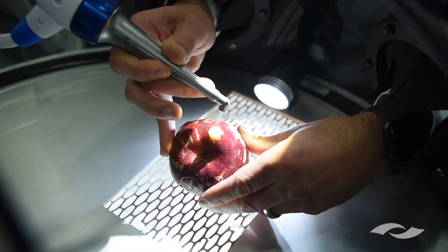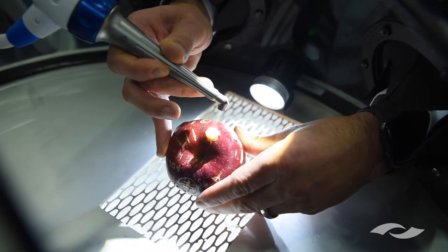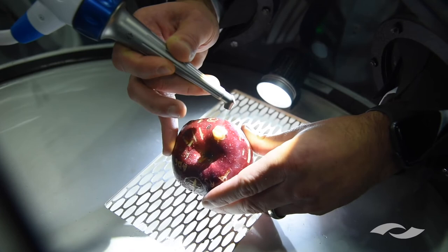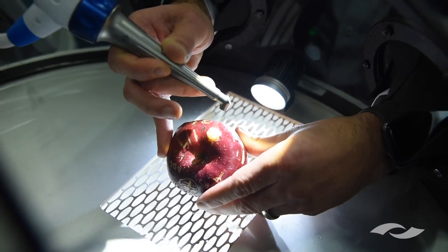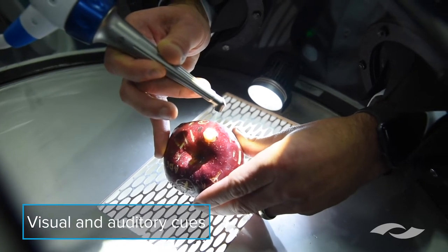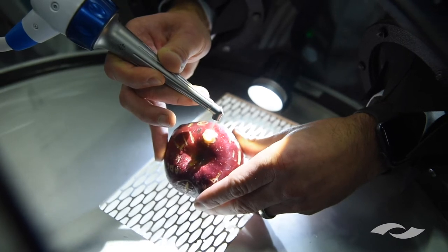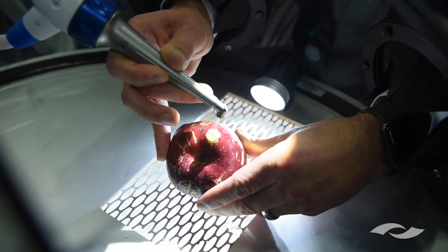As you penetrate through different layers of tooth, the water concentration changes. So as I get through this enamel, you'll notice that the plume all of a sudden starts disappearing — and what we're doing is we're now into dentin. Based on the visual and auditory cues, we now know what tissue we're cutting, and I can vary the intensity based on that tissue.